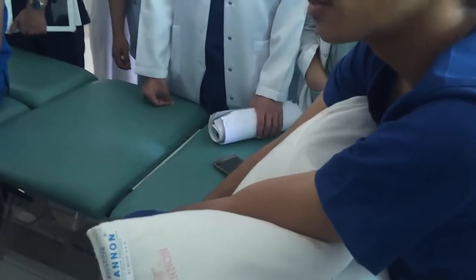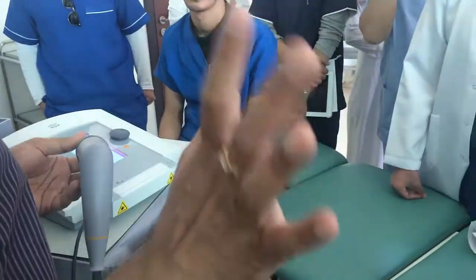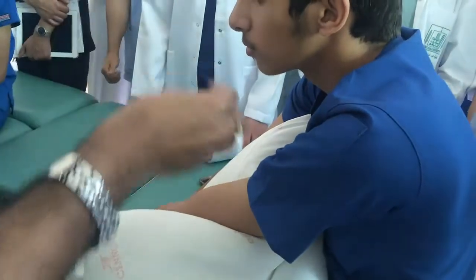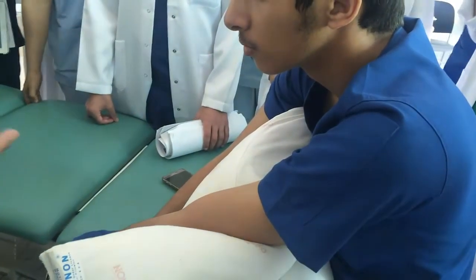Understood? For open wounds, we should not touch. Other things we should touch. It should be perpendicular. Is it clear? So like that, I'll be asking different problems: neck pain, elbow pain, wound, knee pain, joints. Okay, you should give laser.